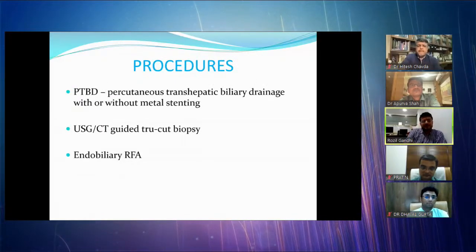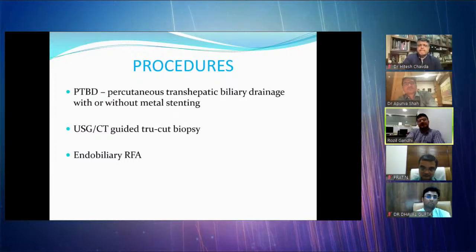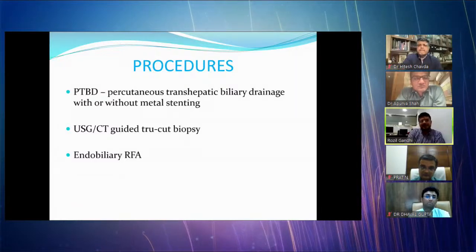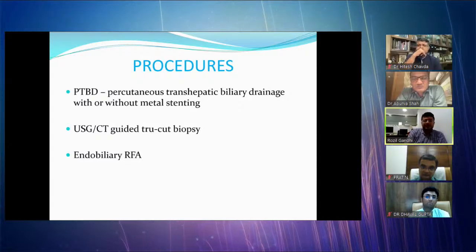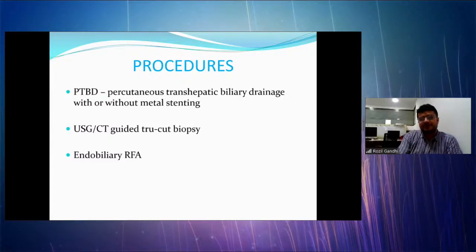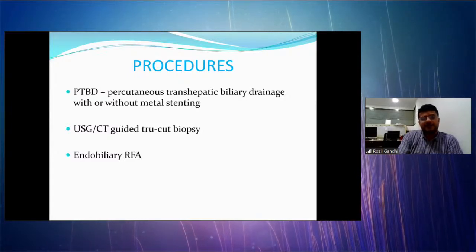So what all things can we do? We do PTBD. Generally it is a common thing that PTBD is just a biliary drainage and there is some tube jutting out of the body, but it is not so. We can, and we generally also, put metal stents. So there is nothing like an external drain for a lifetime.